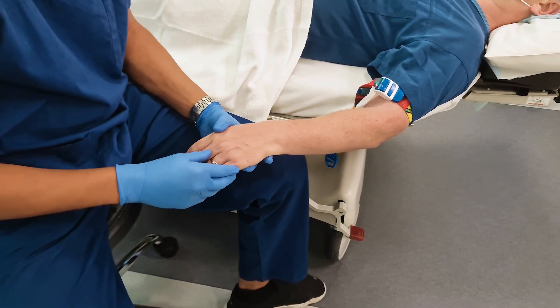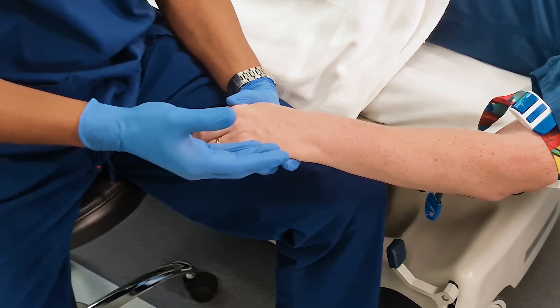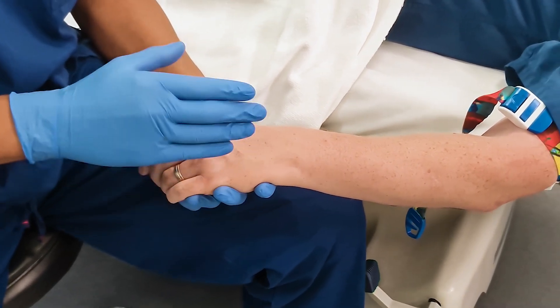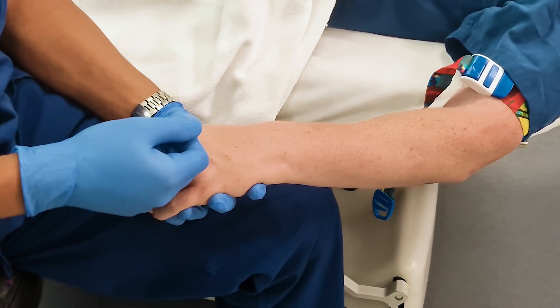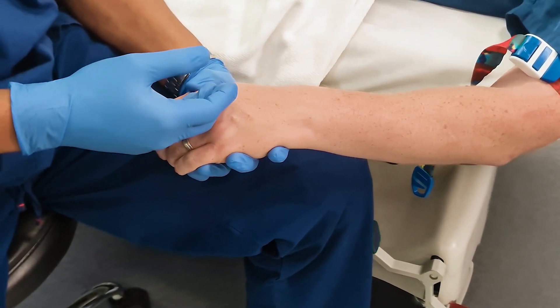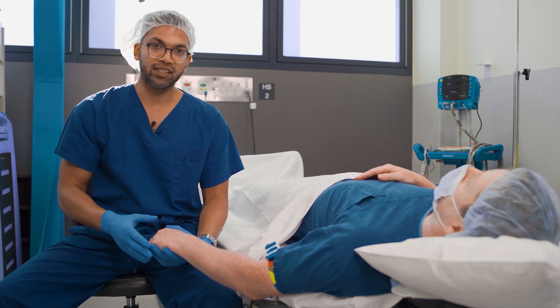The hand is one of the most common sites of cannulation. As you can see in my friend, who is very gifted with the amount of veins he has, there are a lot of options. It's also a very easy site — you can get a nice low angle, there are lots of options, and you can get some big veins and some small veins, so it's a very common site to go for.